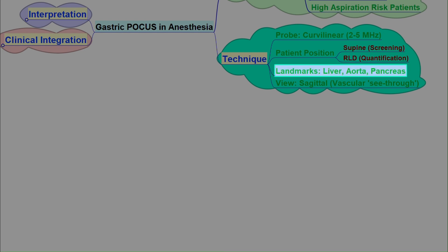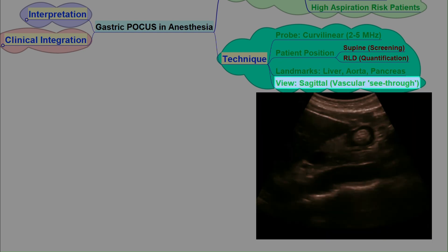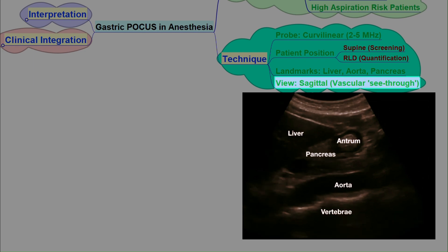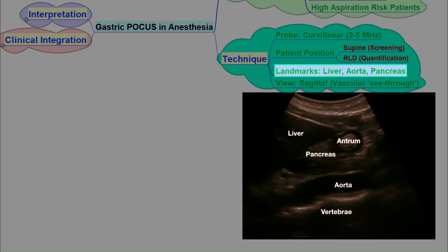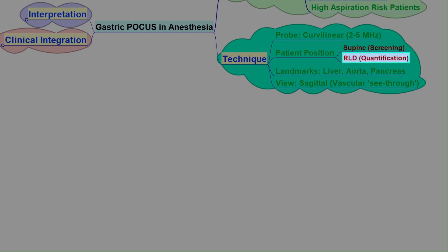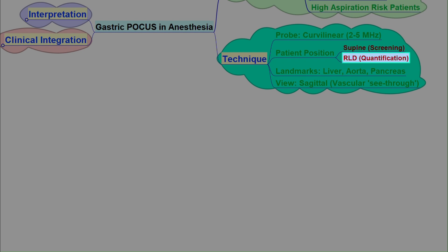The main structure we focus on is the gastric antrum, located just below the liver. The protocol involves scanning in two positions: first supine for a quick screening, then, if needed, right lateral decubitus. This allows fluid to settle in the antrum, making it easier to visualize and quantify.